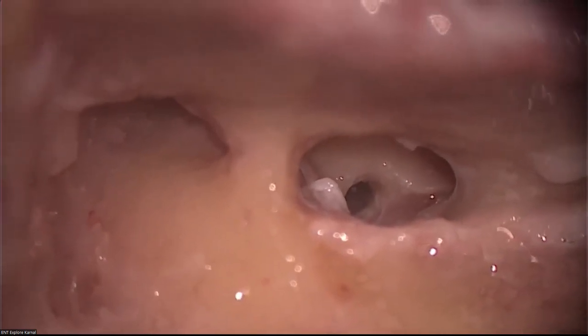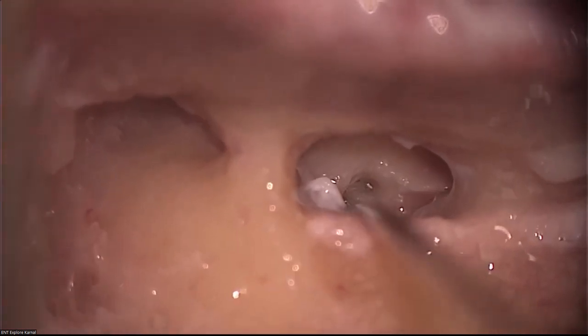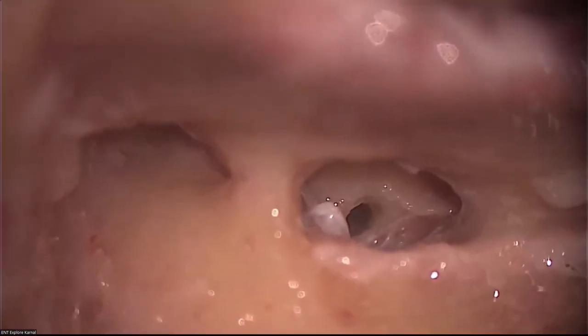Now, can you show with Prolene if you have, by putting it in? I will show. I'll put my endoscope also later.